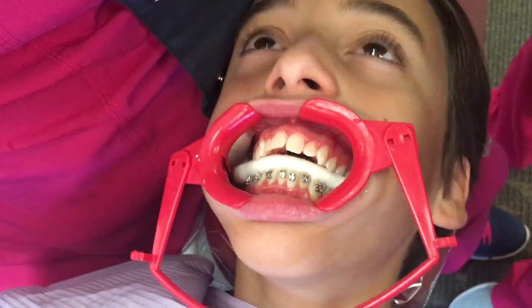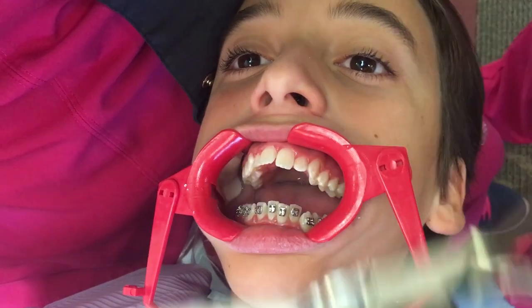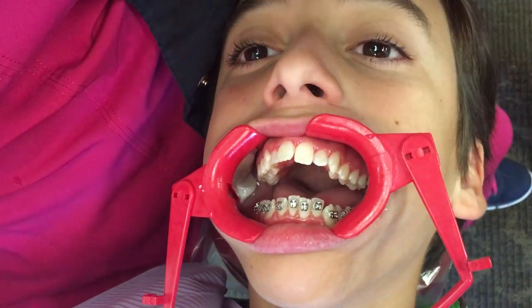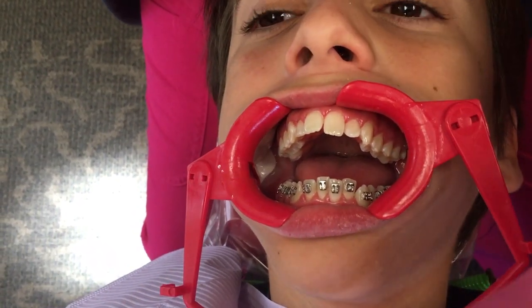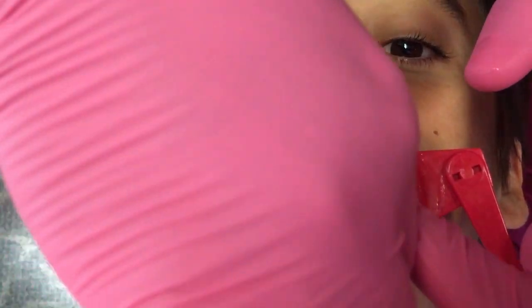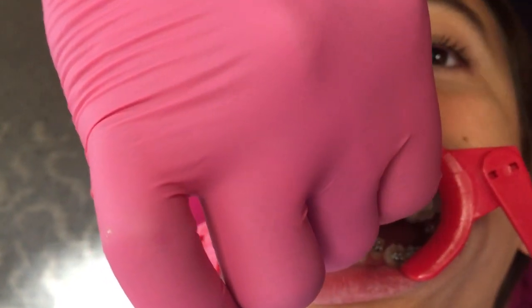Now bring it to you, get your light away, grab the ring guard, open gently. Gentle open a little bit, grab it. Okay, now where are your centrals? Visualize your centrals in the tray. Perfect. And then now from behind. Okay, so now — don't touch the pad, that's why you pinch it this way — get it as close as you can from the central. The centrals are marked. Okay, left hand V-shape, remember V-shape.